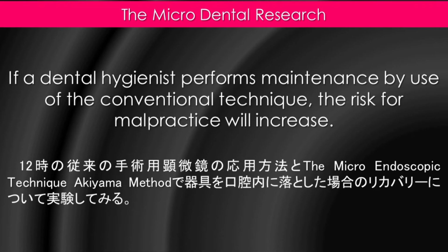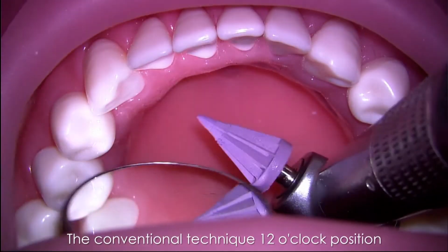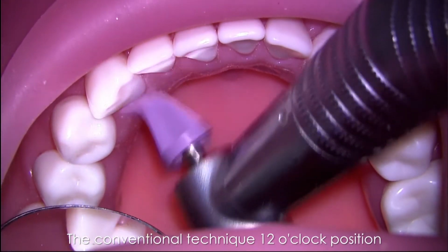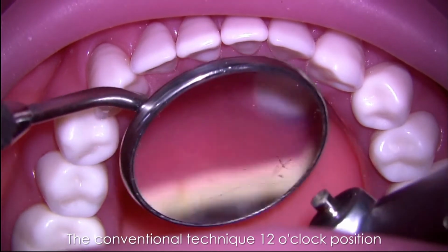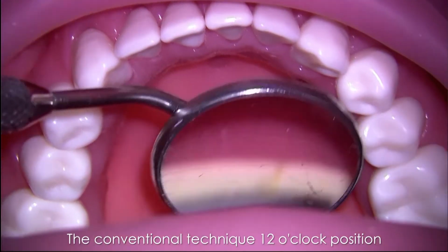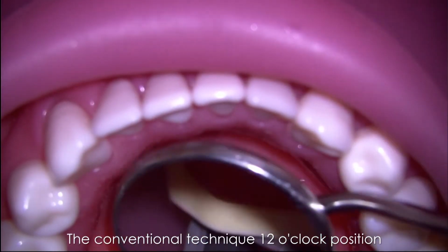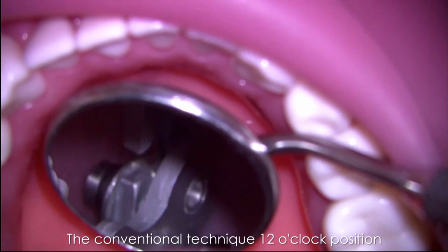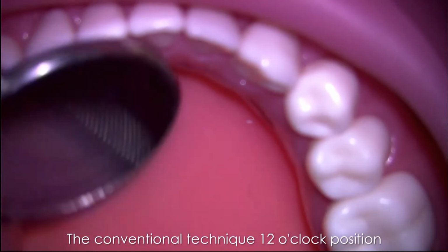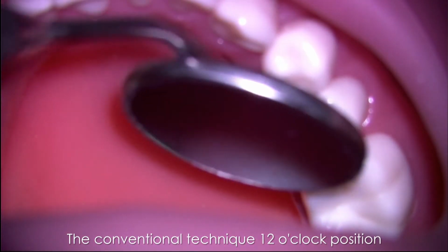This is a conventional technique, 12 o'clock position. This is so easy to understand. If some problem happens, it is very difficult to recover, because the conventional technique has an obstacle between the operator and the patient and the field of view is limited by the mirror's width. Very narrow field of view.